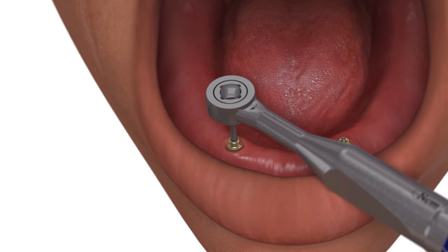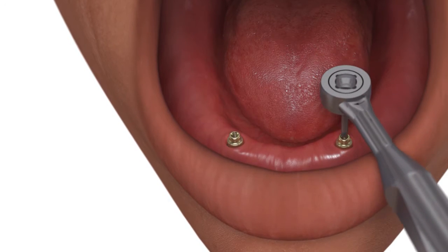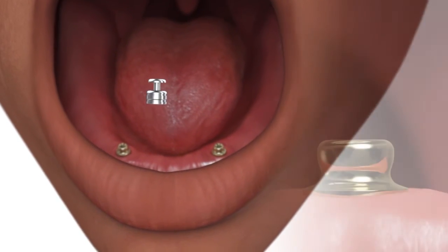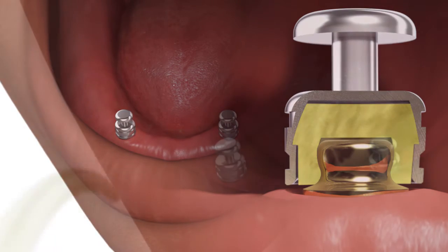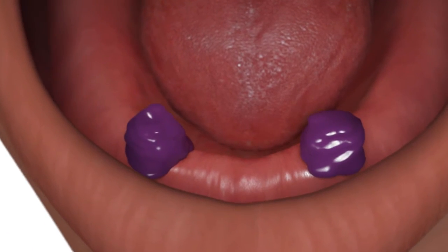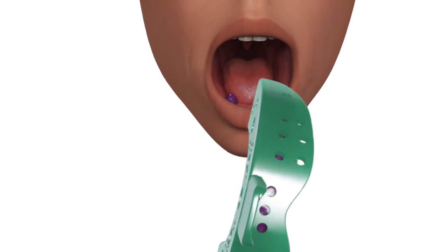Tighten each OD Secure abutment to 30 Newton centimeters using an 050 hex driver and a calibrated torque wrench. Snap an impression coping onto the OD Secure abutment. Step 2: Syringe medium or heavy body material around and over the coping body. Load the impression tray with material and make the impression.